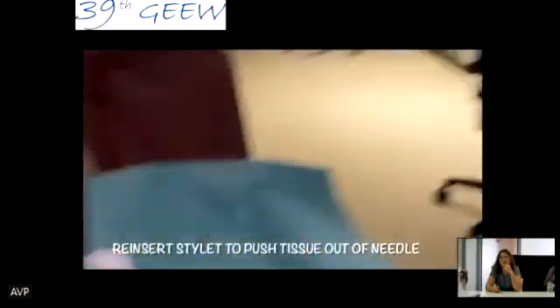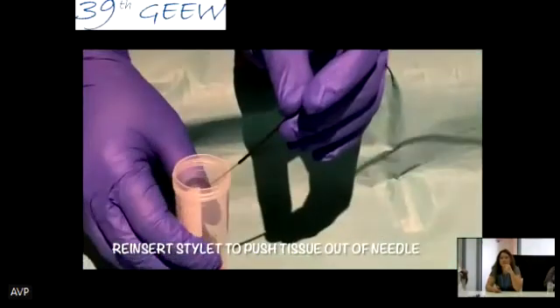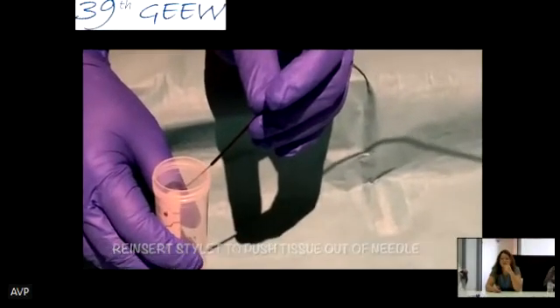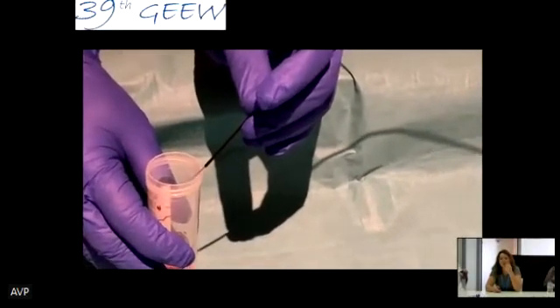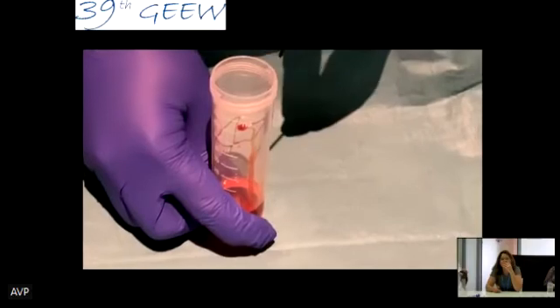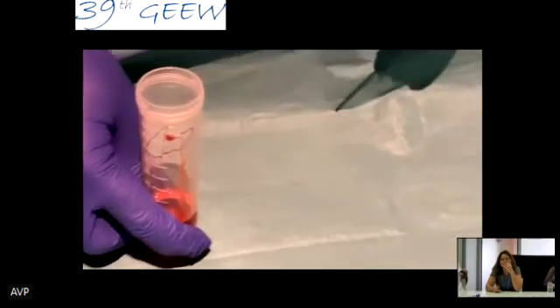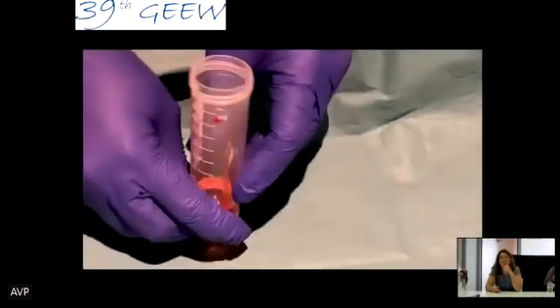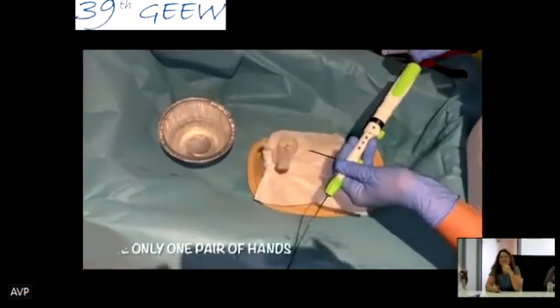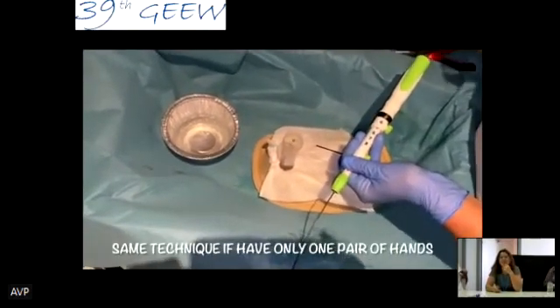So we reinsert the stylet to push out the tissue. And here we show it with two operators. We see this good tissue acquisition. And now we'll also show how to do it if you're by yourself. So two hands, not four hands, only one pair of hands.